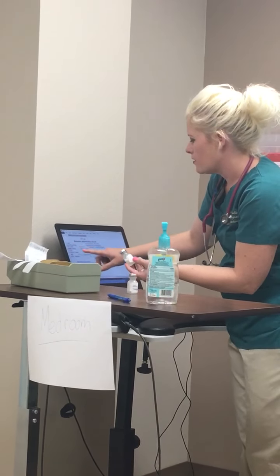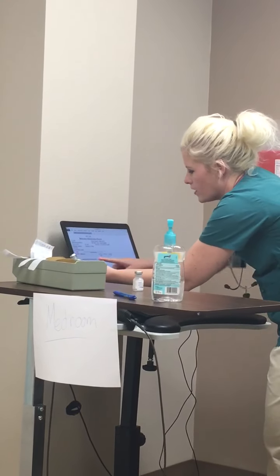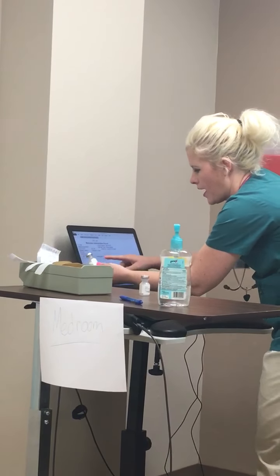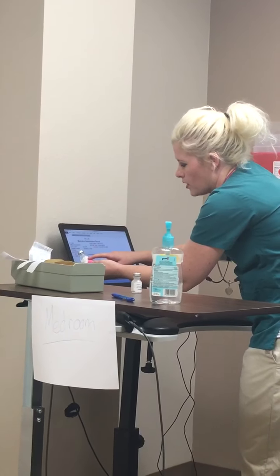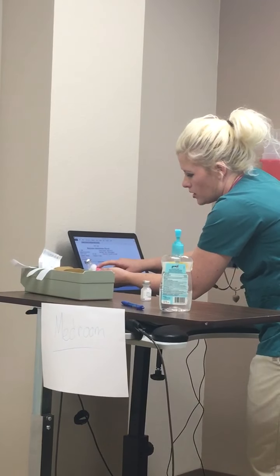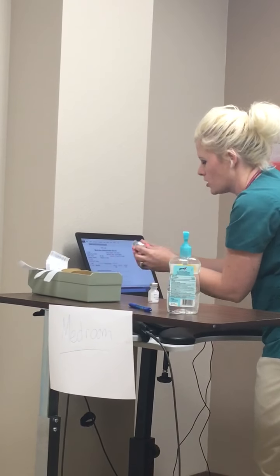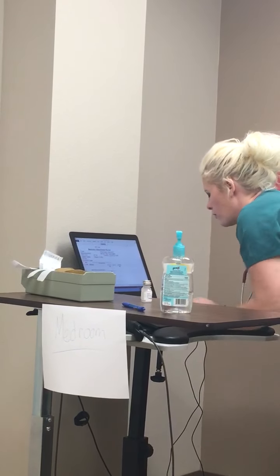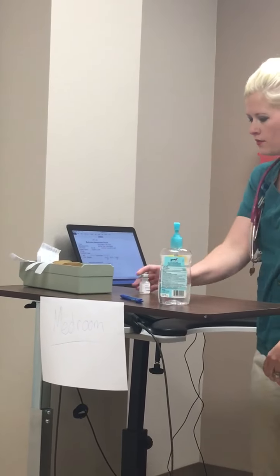I have B. Smith, date of birth 4/24/57, allergic to codeine. I have influenza vaccine, IM ×1 now. I'm giving a 9 a.m. dose. I have influenza virus vaccine, lot number 107057, expires 10/30/20. Dosage is 0.5 mils equals 1 adult dose, and my package is intact and unopened. I've performed my first check. Now I'll go to my second check.